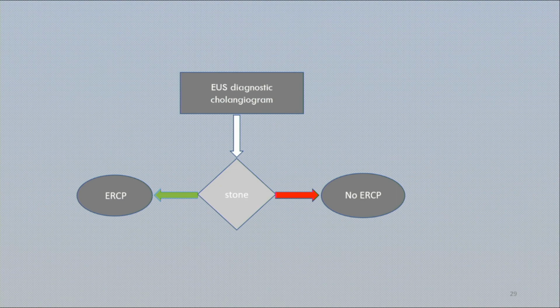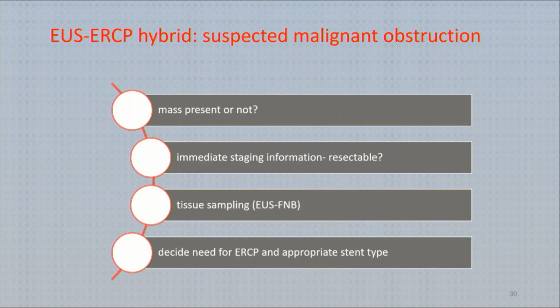If you don't find a stone, you can spare the patient from ERCP, because ERCP is one of the endoscopic procedures which has one of the highest risks and complications. So by this you can triage the patient and avoid a risky procedure.